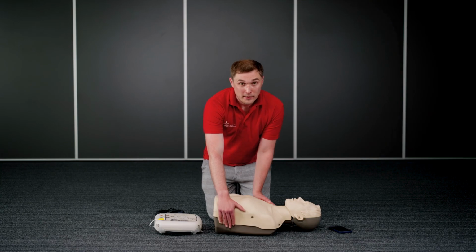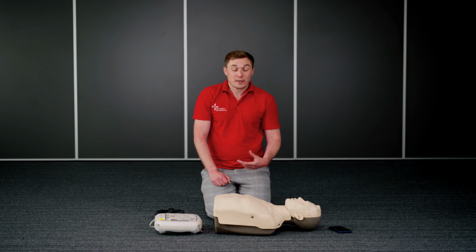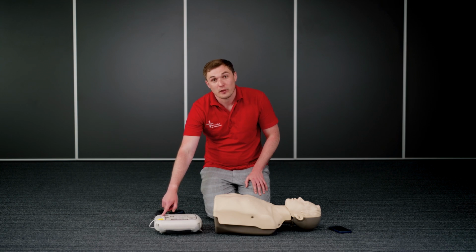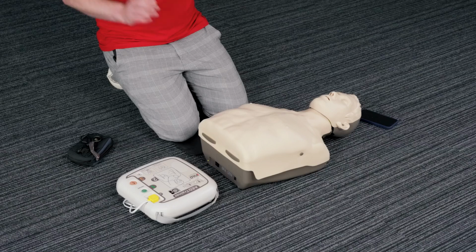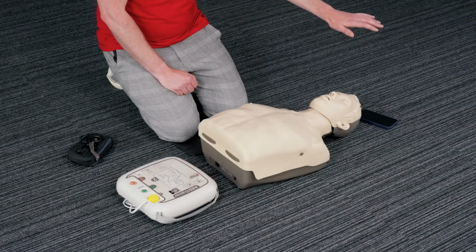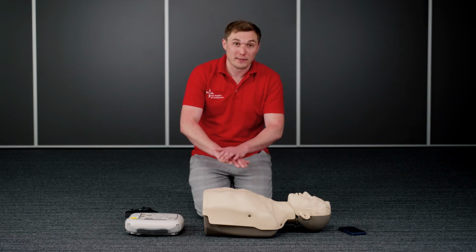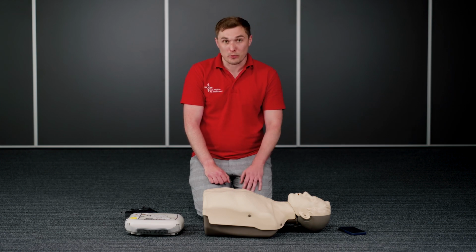After these pads are in place, it will say that it is analysing if there is a shockable rhythm or not. If it decides there is a shockable rhythm, at this point we need to take our hands off of the torso and we will either indicate that we shock this individual ourselves or they will be automated defibs. It's really important through the analysing process and through the shocking process that our hands are away from that casualty and you are making sure any dependents or other people in the area are clear of that shock. After the shock is delivered, I would go straight back to delivering compressions, and every 2 minutes it will analyse if this individual has a shockable rhythm.